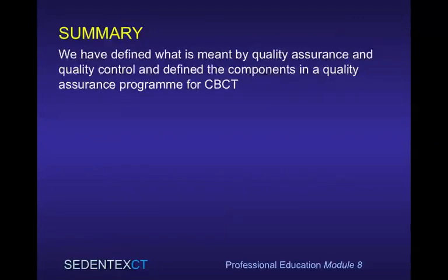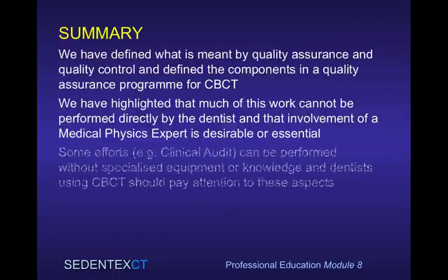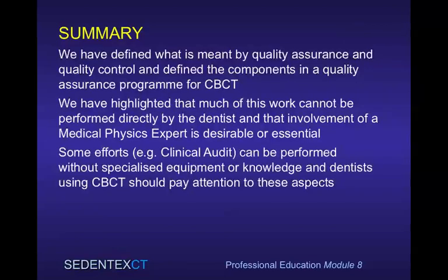So in summary, we have defined what is meant by quality assurance and quality control and defined the components in a quality assurance program for cone beam CT. We have highlighted that much of this work cannot be performed directly by the dentist and that involvement of a medical physics expert is desirable or in some cases essential. Some efforts, however, such as clinical audit, can be performed without specialized equipment or knowledge, and dentists using cone beam CT should pay attention to these aspects.